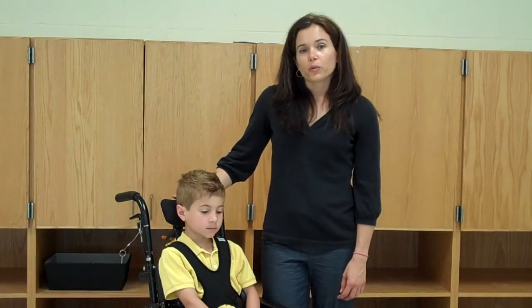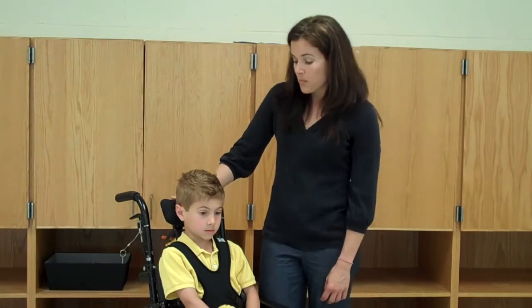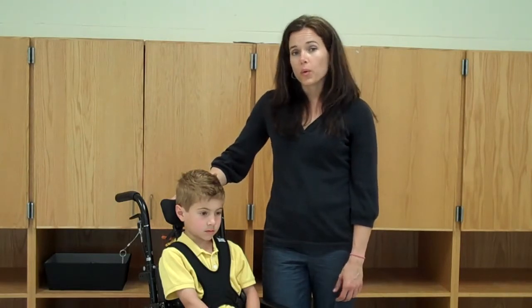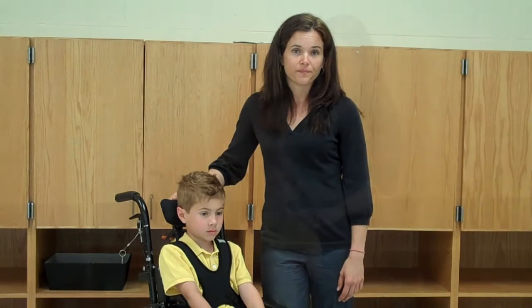Now that we've gone over wheelchair parts and components, let's take a look at how to position a child correctly in a wheelchair. Positioning is very important. Each child has their unique positioning needs. It's very important to ensure that the child is properly positioned because it helps prevent pressure areas, pressure sores, the development of deformities, and it helps the child to be able to manipulate objects and view their educational environment.